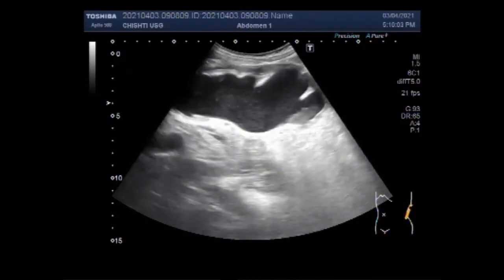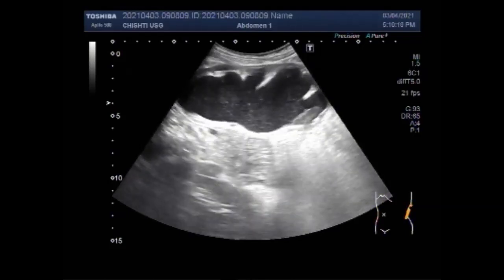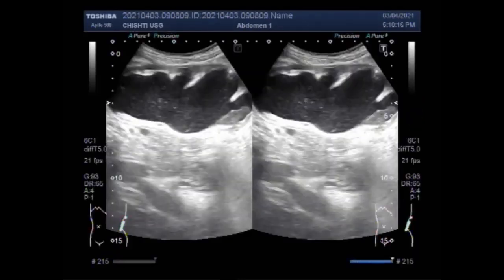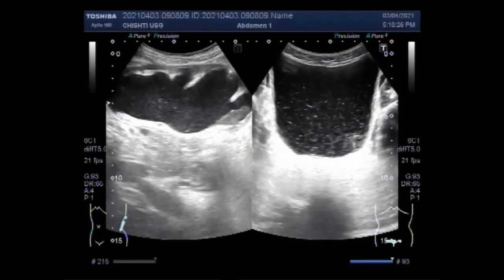When kidneys are failing, the increased concentration and accumulation of substances in urine lead to a darker color, which may be brown, red, or purple. The color change is due to abnormal protein or sugar, high levels of red and white blood cells, and a high number of tube-shaped particles called cellular casts. You can see the urinary bladder is full of sludge, thick sludge.